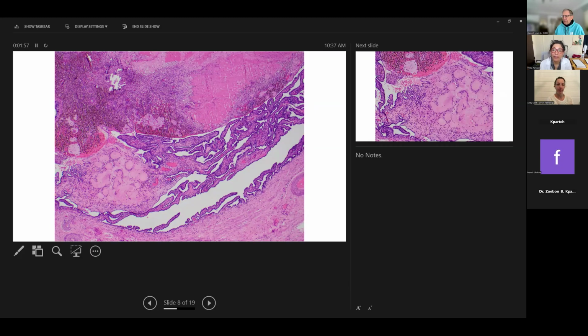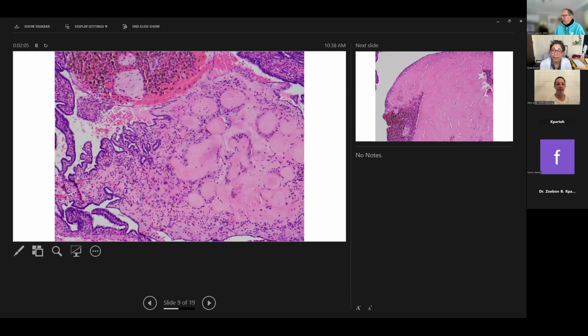It doesn't look like it's granulomatous. It's just a surrounding rim of cells with slightly clear cytoplasm. And here you can see there's a little bit of clearing in them, and even a few multinucleate cells. And you're probably picking out that we've got some decidualization-type changes in some of these cells with more abundant pink cytoplasm.